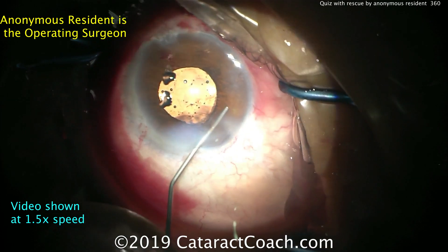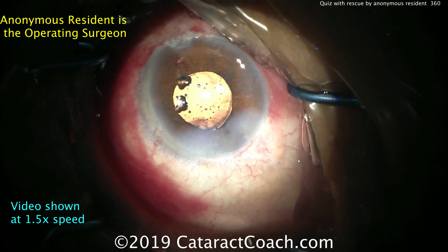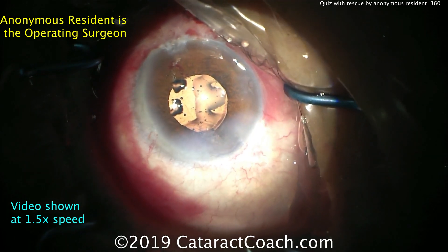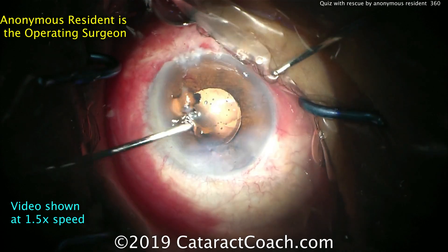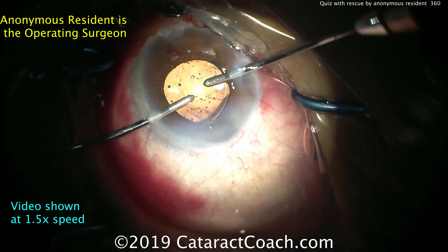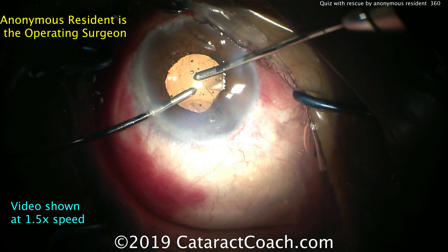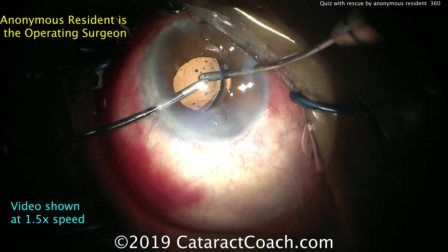Now the lens has been correctly positioned. The incision is being sealed and hydrated, making sure there's no vitreous incarceration. The lens looks pretty well centered. The important thing is the resident knew there was an issue as the lens was going in, and then saved the day when he realized the lens was in upside down — and we righted the ship, correctly reorienting the lens.